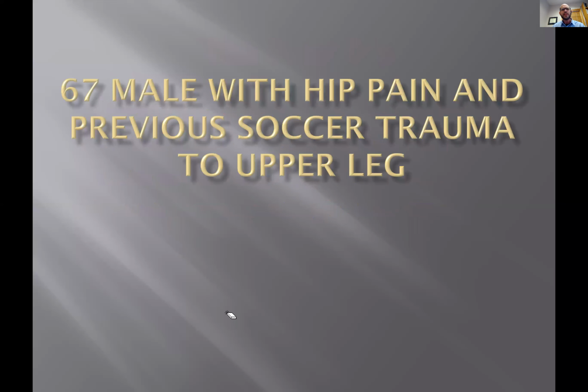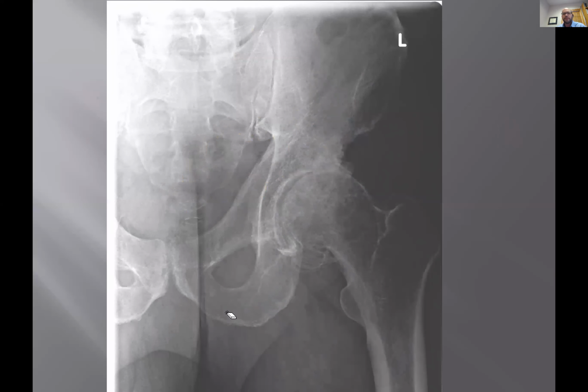Okay, first case is a 67-year-old male with pretty bad hip pain. It's true hip pain. It's not over the SI joint, as when people talk about hip pain, but true anterior groin and medial thigh pain. He did have a soccer injury to the upper leg years ago as well. So both of those nuggets are important. So here's the picture. All right, so take a look.